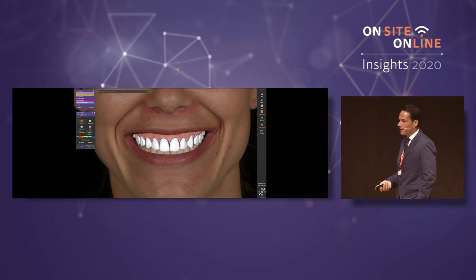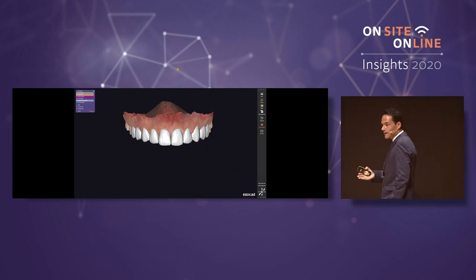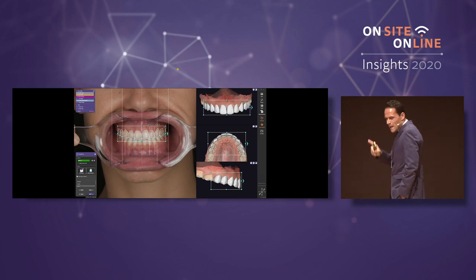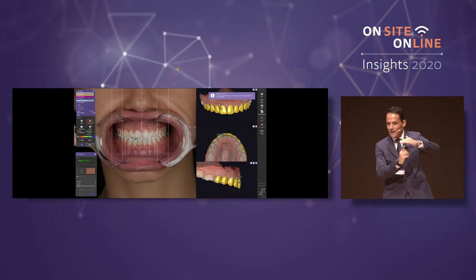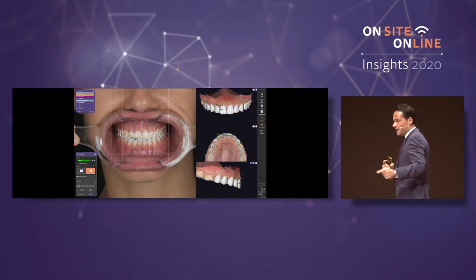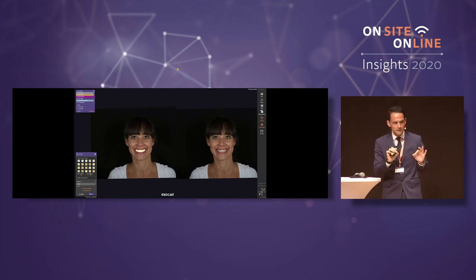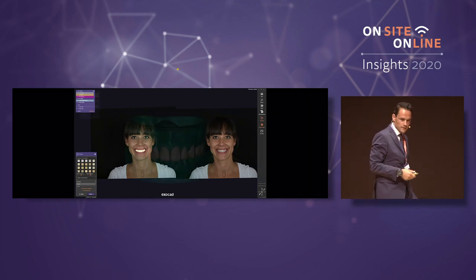We are going to print or mill, hard cut, as Conan showed us. I recommend you to open Smile Creator one more time here, because I have the real position of my margin, and I can make fine movements, because the anatomy now is different. I have not these pontics, remember. And I can make some fine movements. I can make some small modifications on this step.